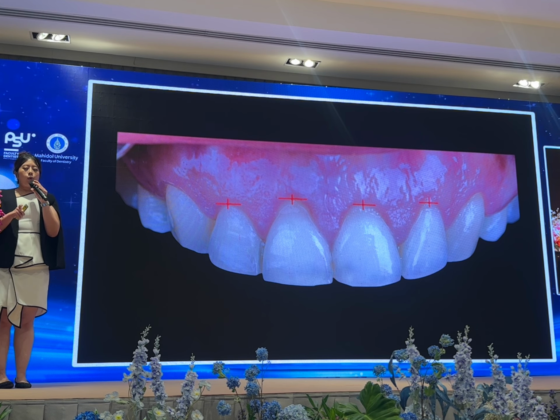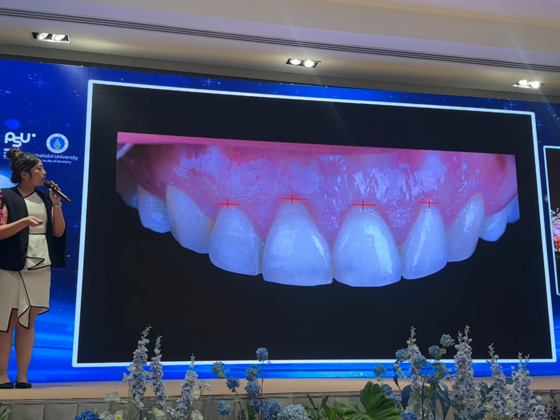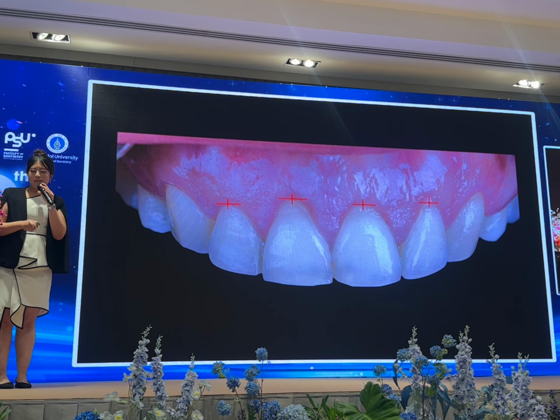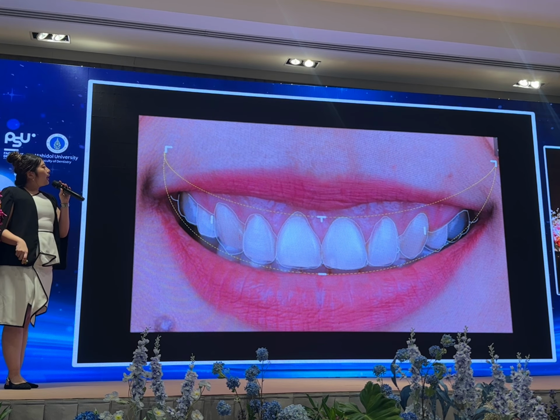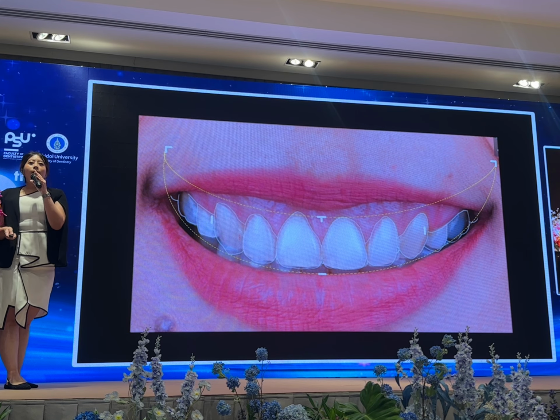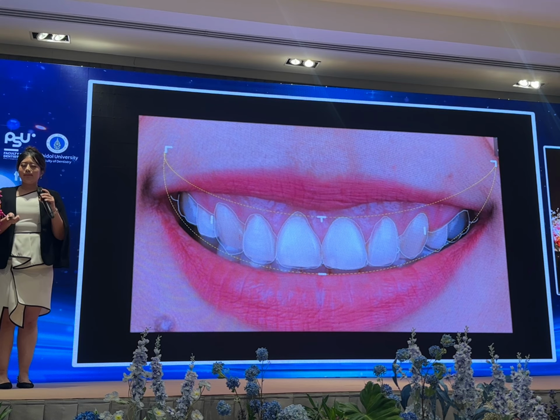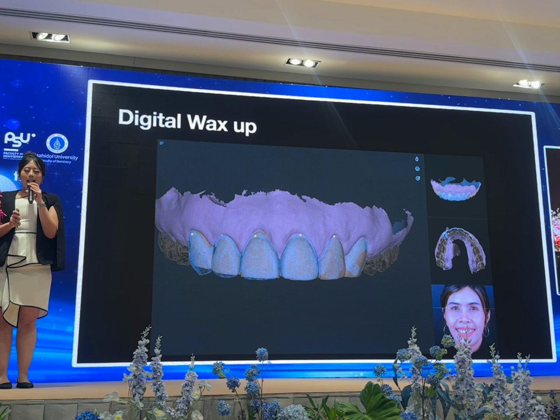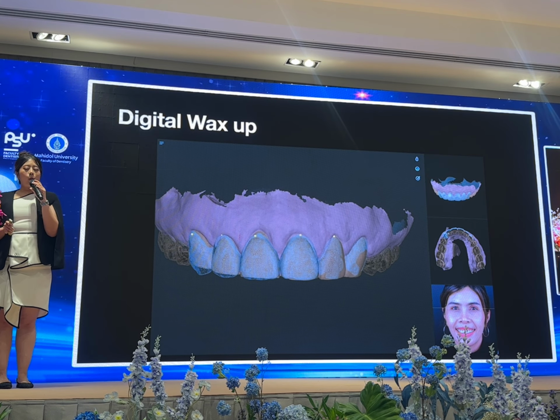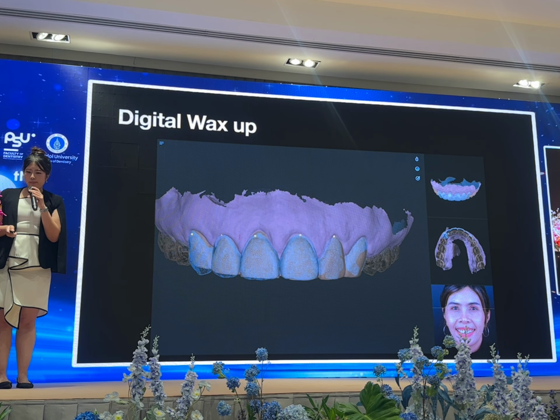There are some creeping parts that you can see on the screen. Do you notice some creeping? We will see more about that, what the 3D can do on the planning veneer. Luckily, now we have the 3D digital smile design available.